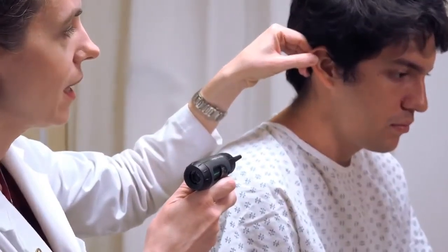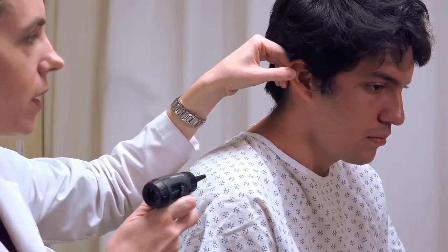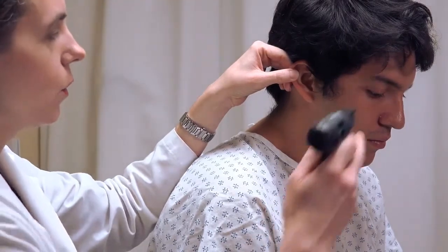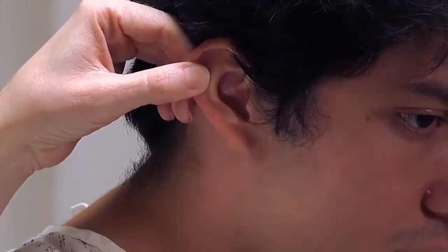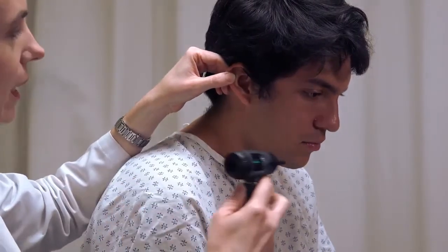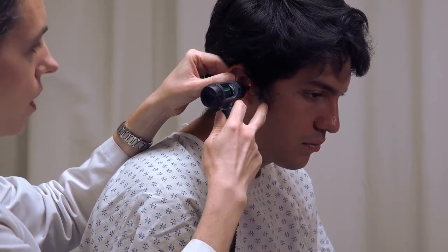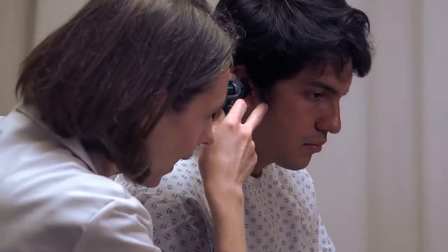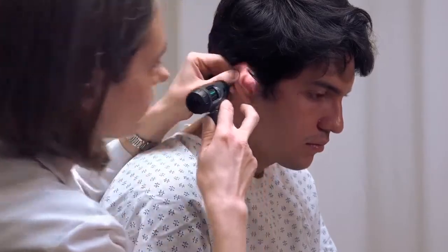Gently pull the pinna superiorly and posteriorly — this is a subtle movement that helps line everything up. When inserting the otoscope, make sure you can see the tip of the speculum actually entering the ear canal before looking through the scope. This also allows you to shine the light on the external ear canal and check for abnormalities. Once the speculum is inserted a small amount, put your eye to the magnifying lens and adjust the angle until you can visualize the tympanic membrane.